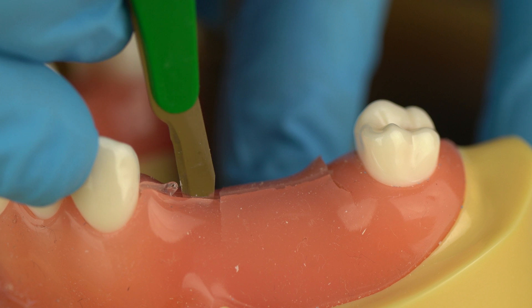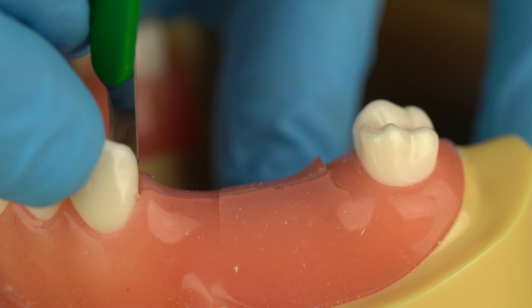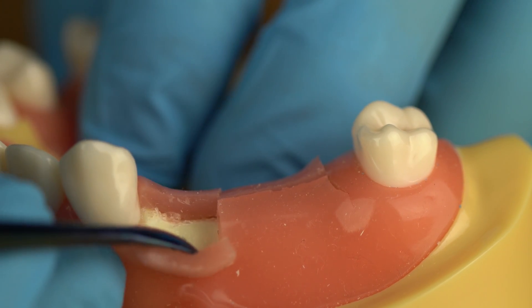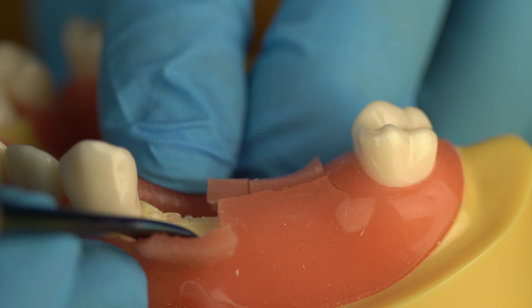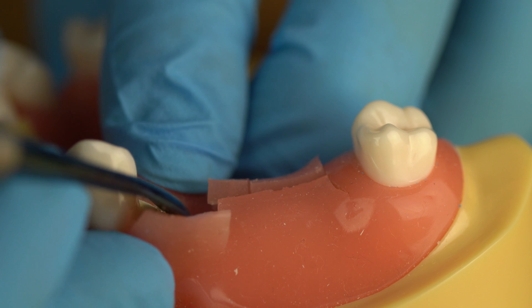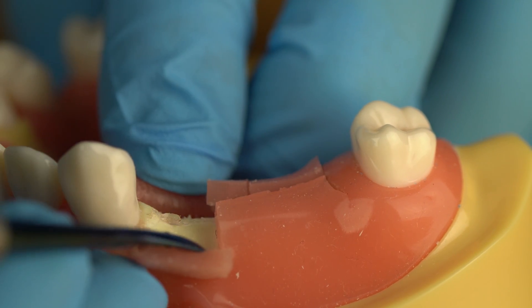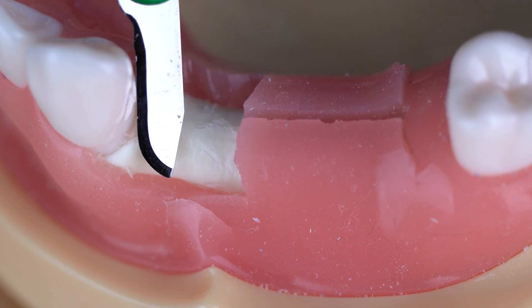After you've already made your flap — here you can see I've already made some intrasulcular incisions — you should be able to see your buccal wall and your lingual wall. By having access to both borders, you'll be able to see exactly how wide the ridge is and pinpoint exactly where the midpoint is. I've gone ahead and cut away the gingiva to show the ridge better.